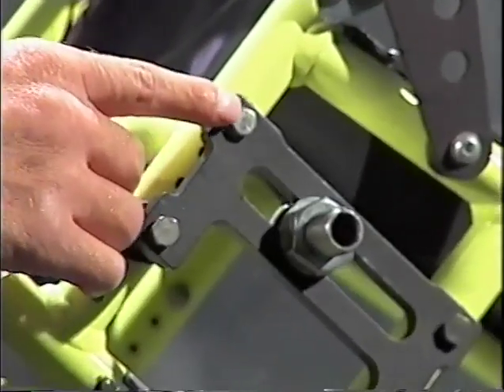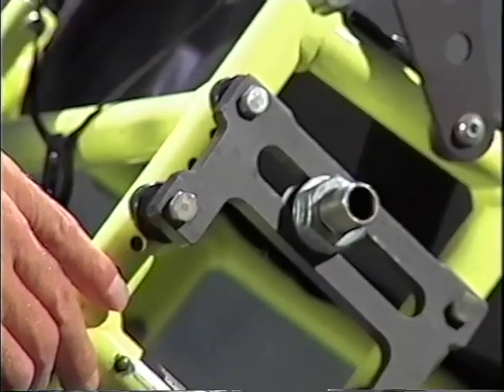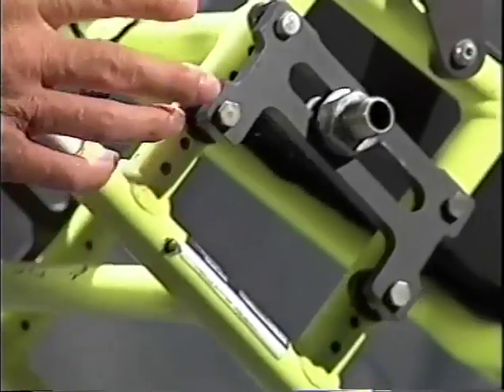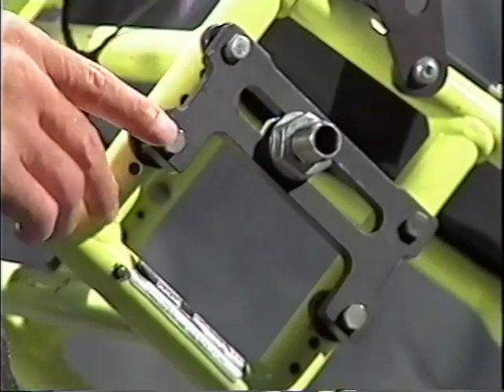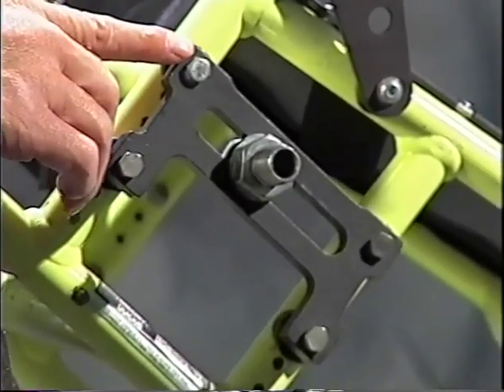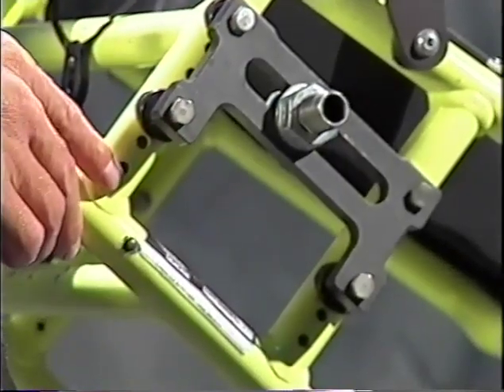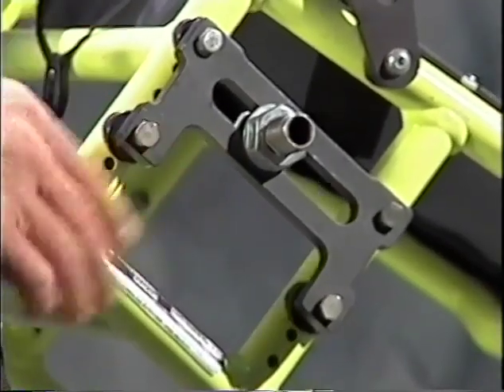This one's at the top, so you can take and lower these by putting them down and lower this by 1 inch, which will effectively raise your seat up, take some of the dump out. So if you have a tall cushion, you may want to raise your axle plates all the way to the top. If you have a low cushion, you may want to put your axle plate at the bottom, depending on your body height and all of those things.